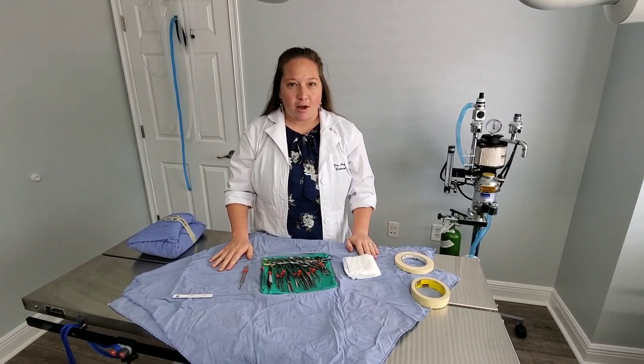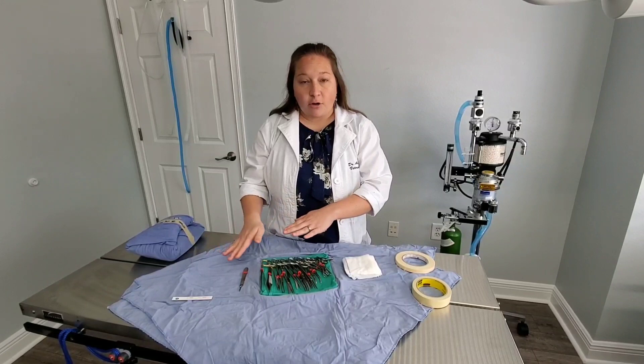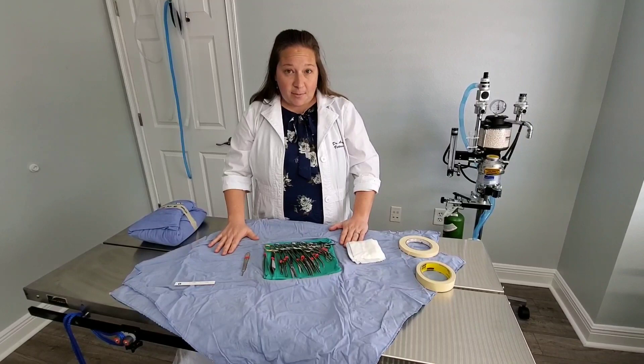Hey everyone, good morning and thank you for joining us at Forever Family Animal Hospital. I'm Dr. Armstrong and today we're going to talk about our surgery instruments. There are different surgery packs that have different instruments in them, and different surgeries require different kinds of instruments. We're going to go through each of the instruments, their special names, and the special task each has for tissue handling.